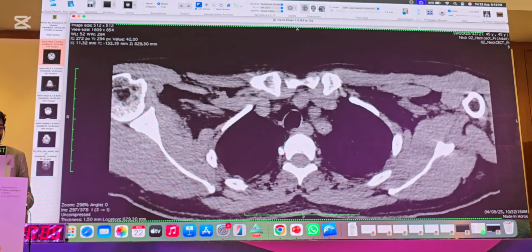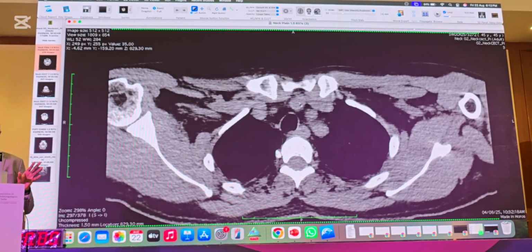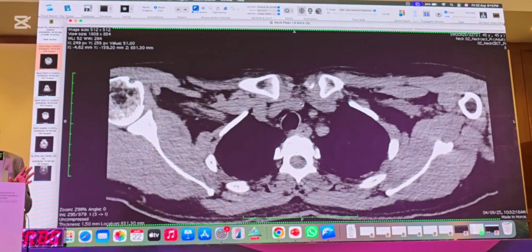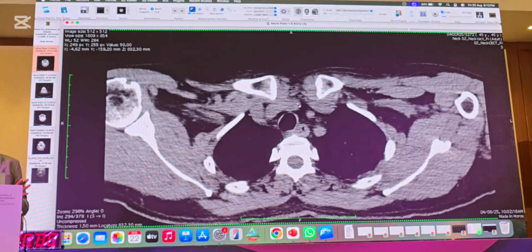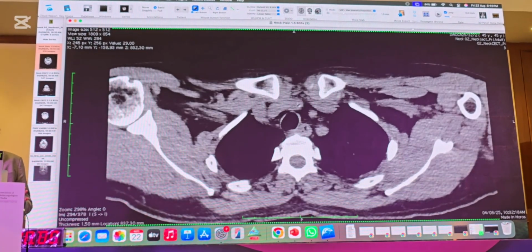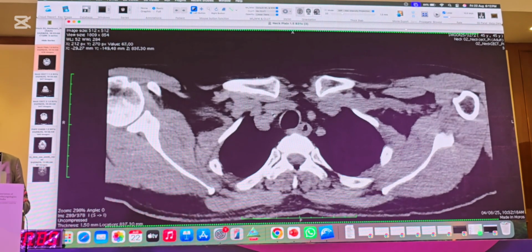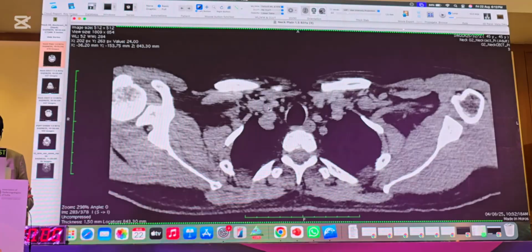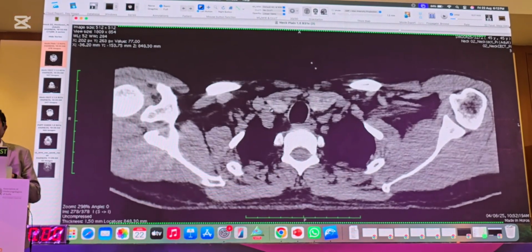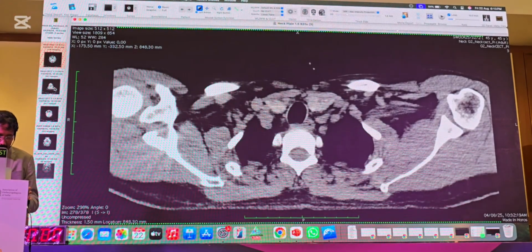So on the right side, this is the right brachiocephalic, dividing into, you can see that, follow my arrow, coming up, the right subclavian, here it goes. Okay, so this I will show you with contrast, so that will be better.